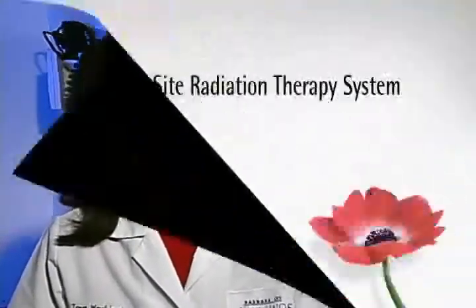Mammosite and other partial breast irradiation techniques treat only the tissue that's at highest risk for recurrence. That means we can spare or exclude the normal breast tissue away from the lumpectomy site from the effects of radiation therapy.